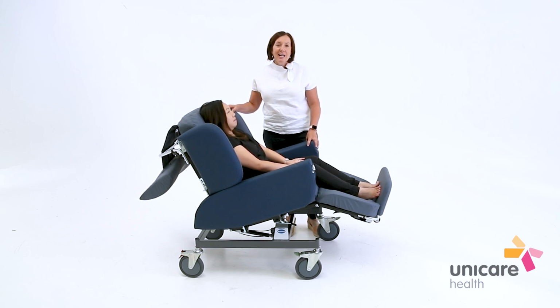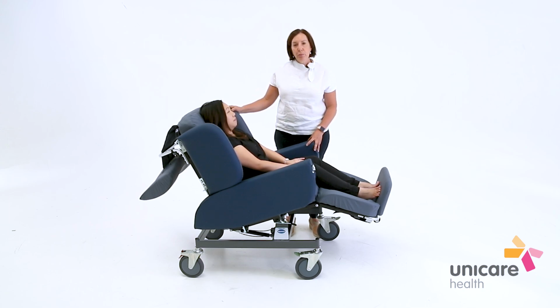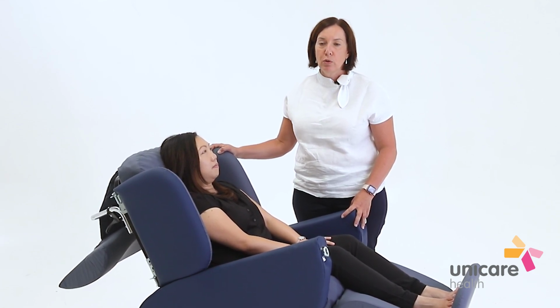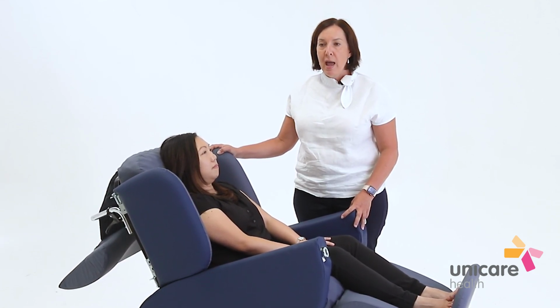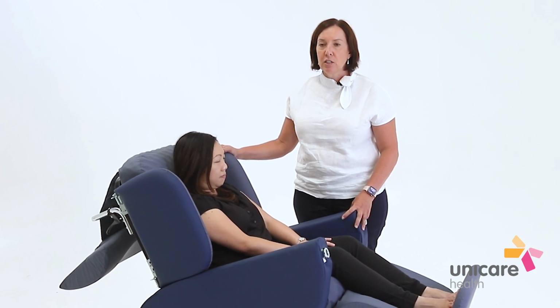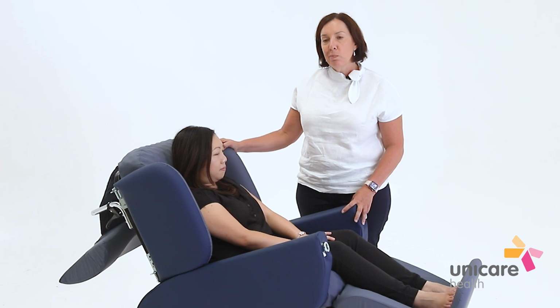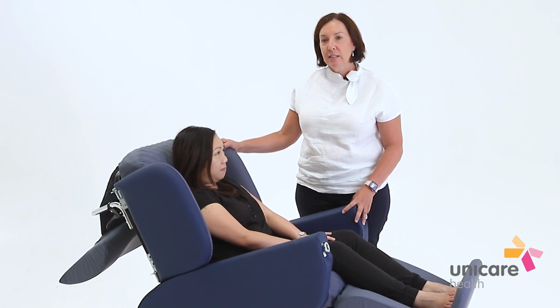Keep in mind that Dartex is a fully waterproof material. However, when it comes into regular contact with urine under the pressure of the seated user, the urine may eventually eat away the waterproofing fabric and it will soak through to the foam below. It's best to regularly wipe over the seated surface to avoid concentrated urine buildup and monitor the status of the seated surface, looking for any cracks or white streaks that may appear in that Dartex.